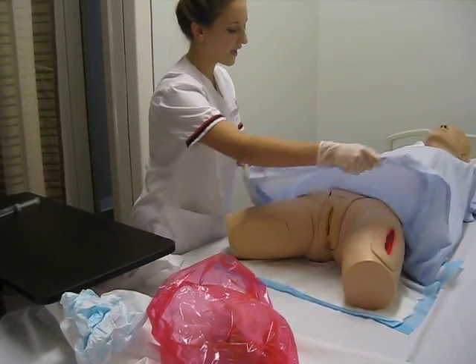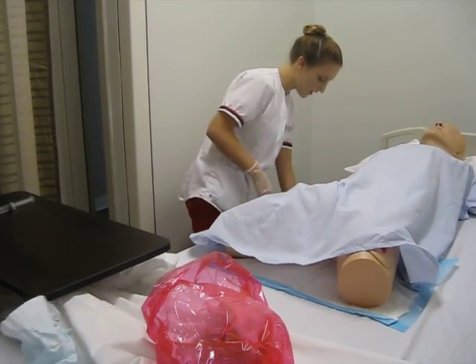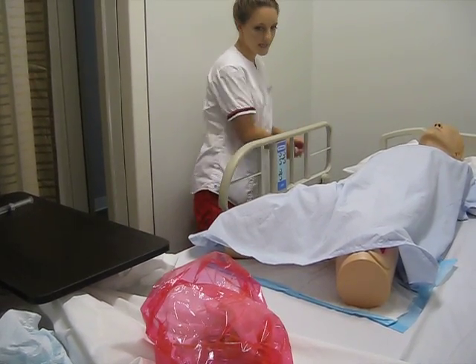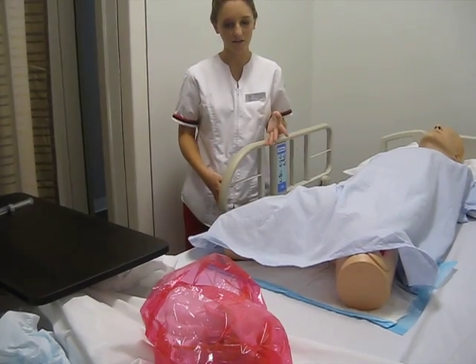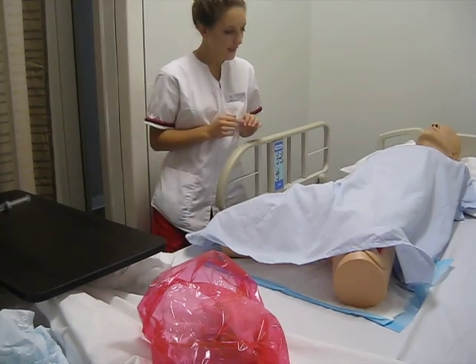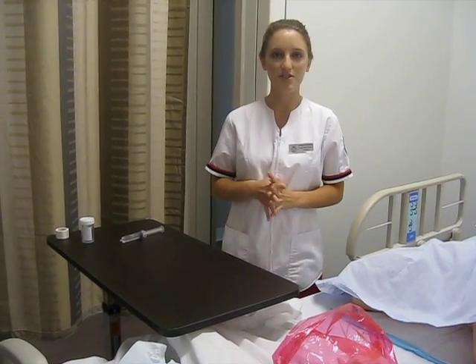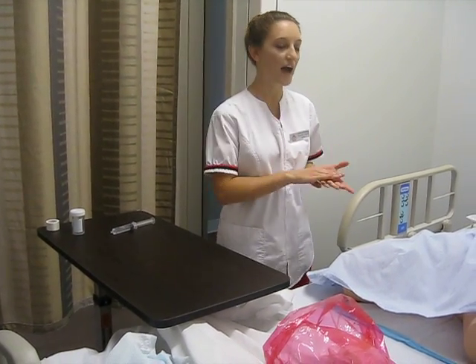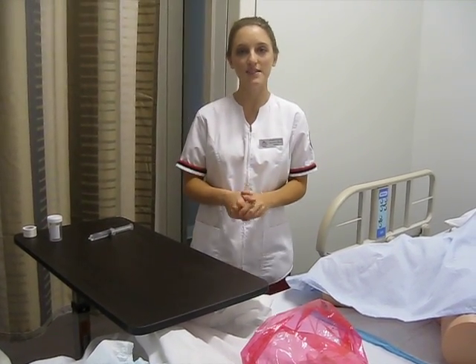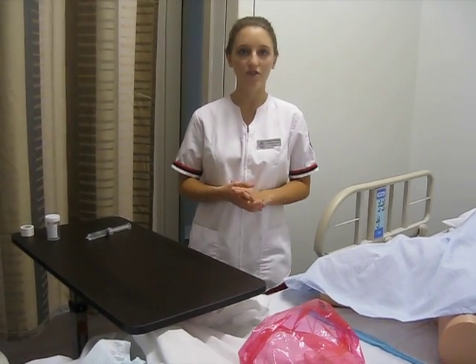Thank you so much, Amy. Is there anything else that you need? Here's your call light. I would take off my gloves and wash my hands. Normally I would lower the bed and raise the side rails. I've washed my hands already. I'm going to document that I left the patient, how the patient tolerated the procedure, that the catheter was intact when it was removed, and how many CCs I deflated from the catheter.